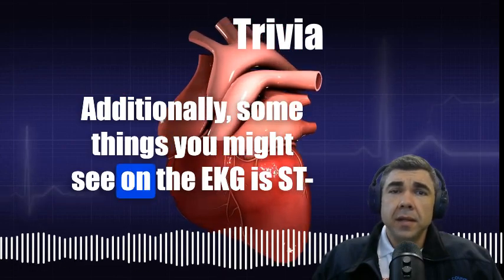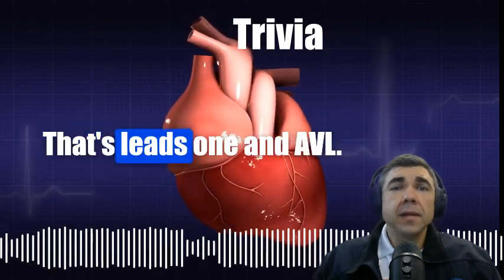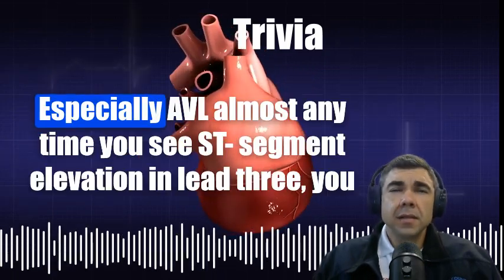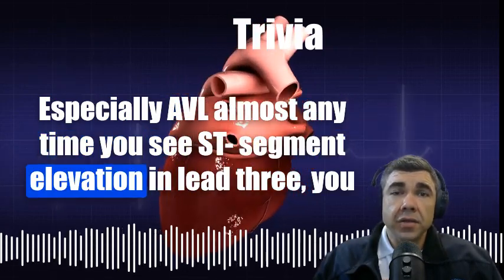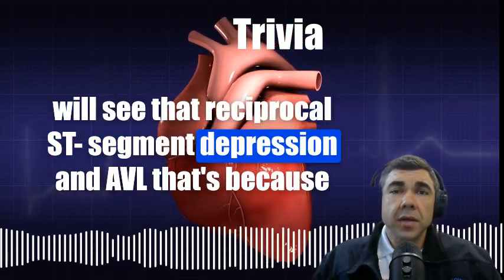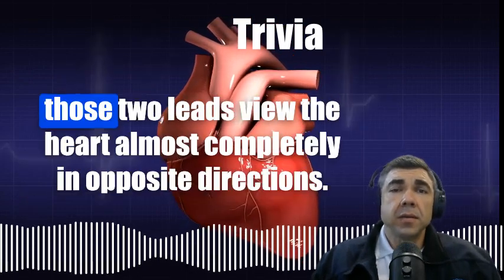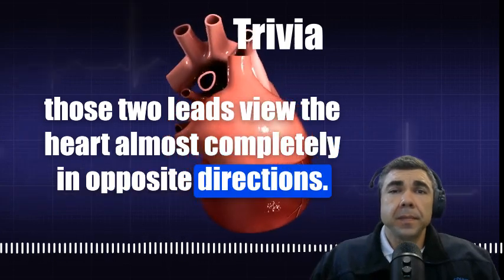Additionally, some things you might see on the EKG is ST segment depression in the high lateral leads. That's leads 1 and AVL, especially AVL. Almost any time you see ST segment elevation in lead 3, you will see that reciprocal ST segment depression in AVL. That's because those two leads view the heart almost completely in opposite directions.